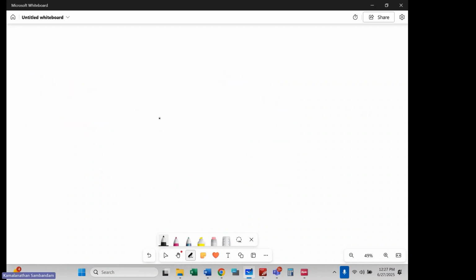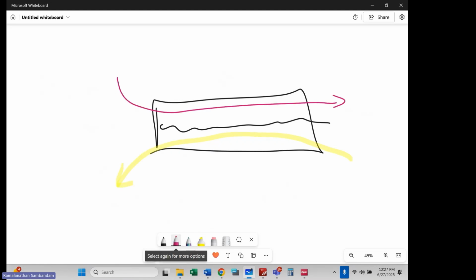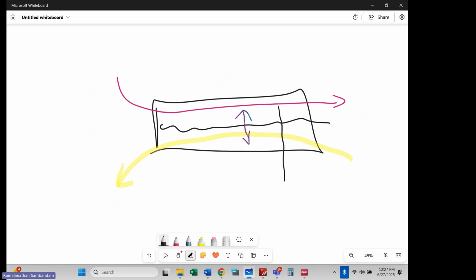okay, as I flow down the dialyzer, right, I have dialysate that's flowing in this direction. I have blood that's going in this direction. Solute is moving, right, by diffusion, but I'm not getting any hemoconcentration unless I'm simultaneously pulling some water out of the patient to shrink them.